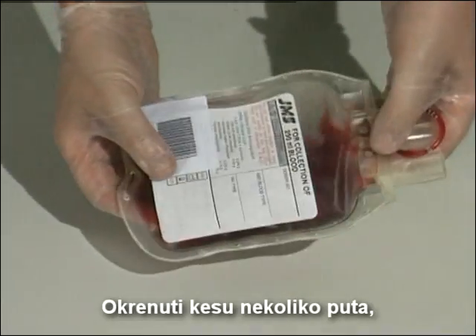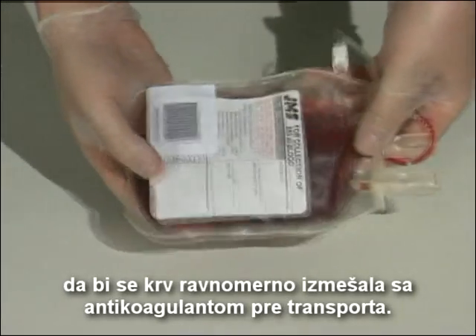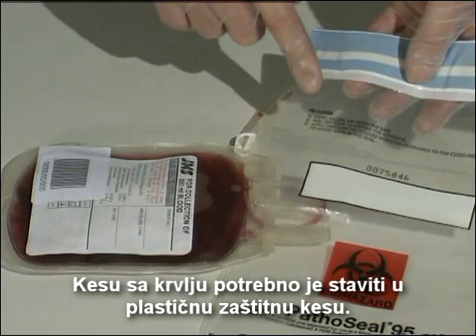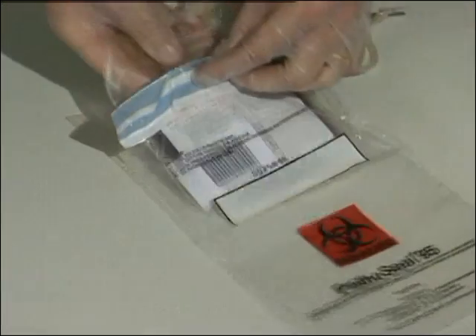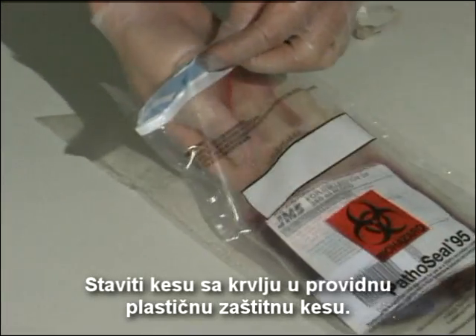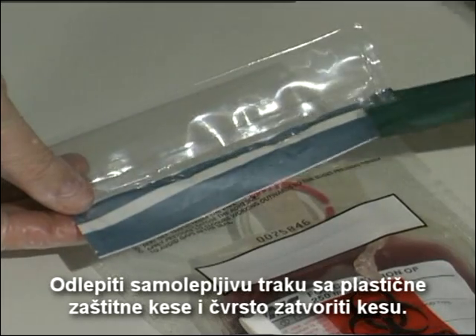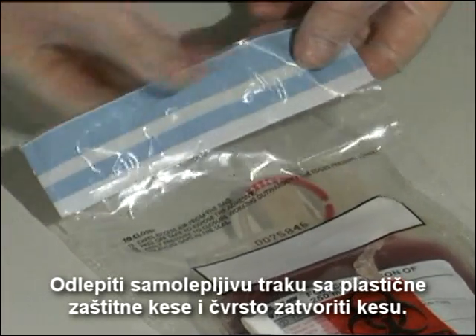Turn the blood bag around to ensure a good mix before preparing it for transportation. The blood bag should be put into the plastic safety bag. Follow the instructions printed on the safety bag. Place the blood bag into the transparent plastic safety bag, peel the tape to expose the self-adhesive, and close the plastic safety bag tightly.